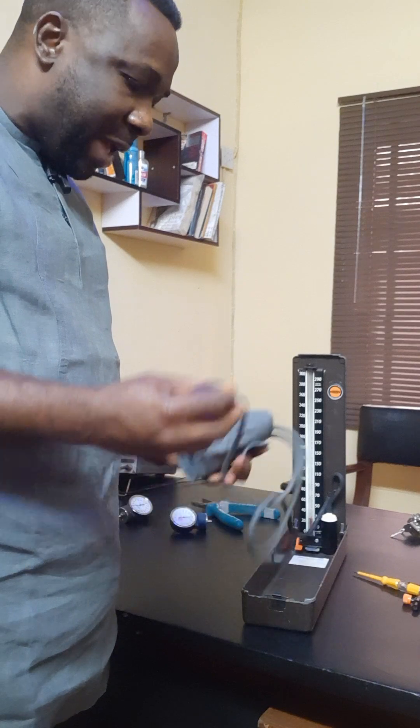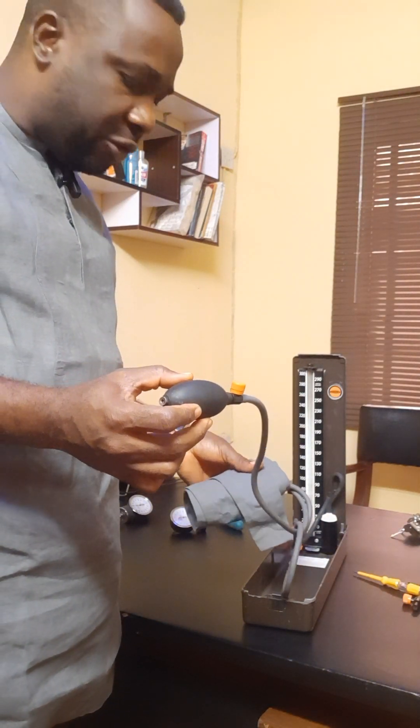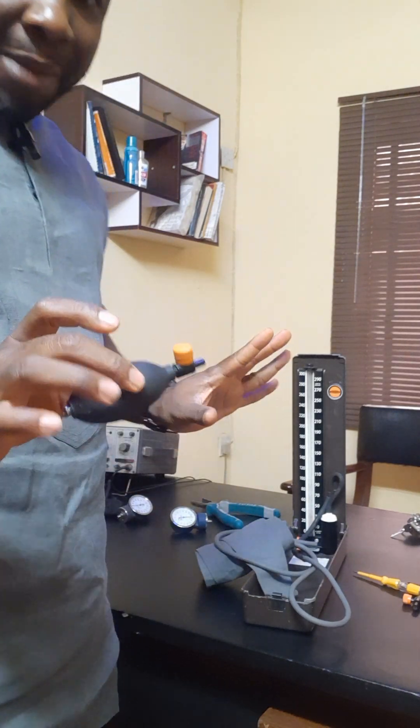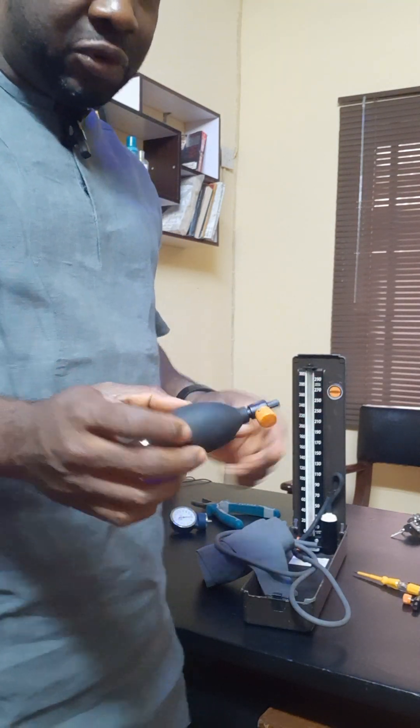So what I'm going to do first is test this very pump to find out if it's okay. I'm going to detach it from the tubing. I'm going to do a very simple test here.